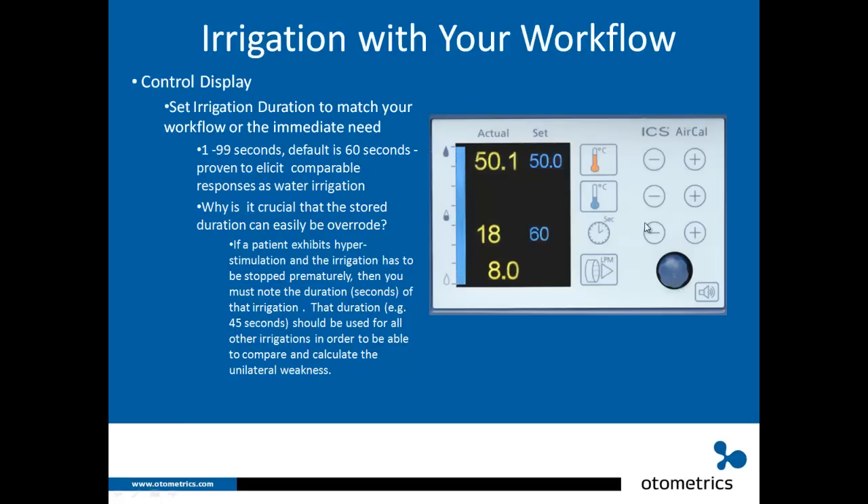To easily change the duration, use the plus and minus buttons. When you click the irrigator head trigger button, it counts down from the set time — for example 45 seconds — to zero. The display shows the remaining time as it counts down. Once it reaches zero, you will hear a beep.